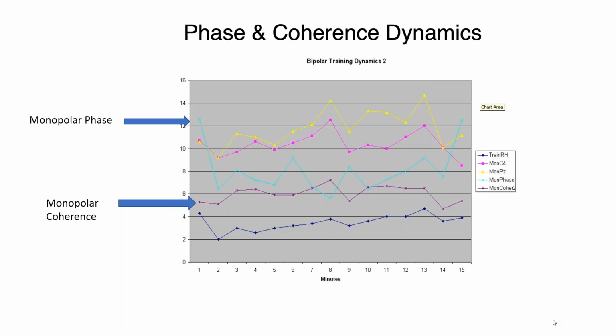It seems that some of the people that have been coming have tried so much to feel better, in spite of their best efforts. And that's usually when I'll work in the bipolar range, when they present it to me in such a way that it says, okay, let's see what happens here. And I always precede it with SMR at CZ. I might go 7 to 14 instead of 12 to 15, and I'll do 8 to 10 of those just to get started that way before.